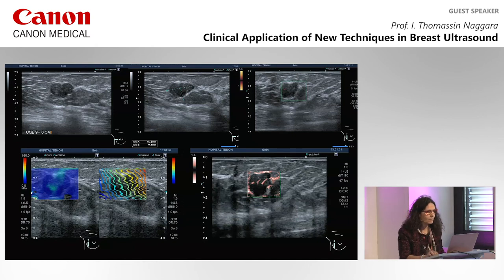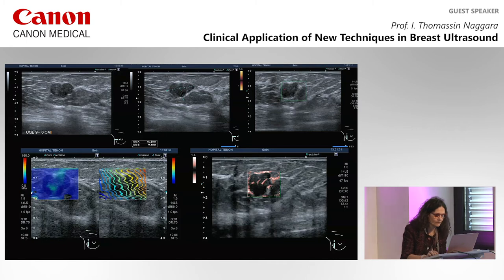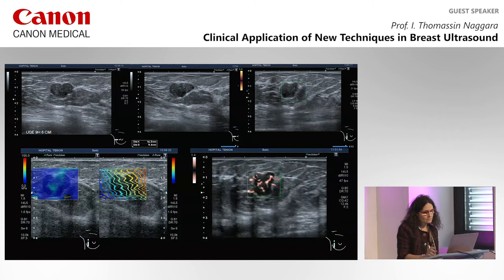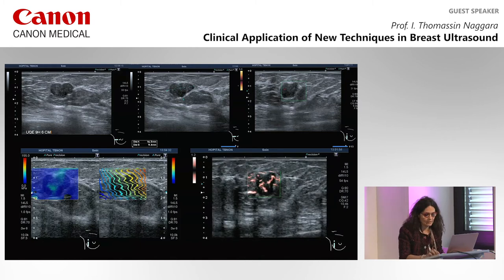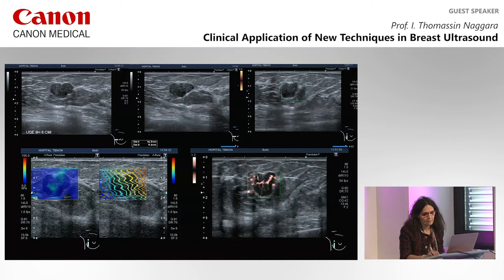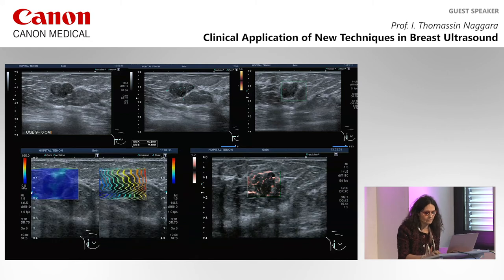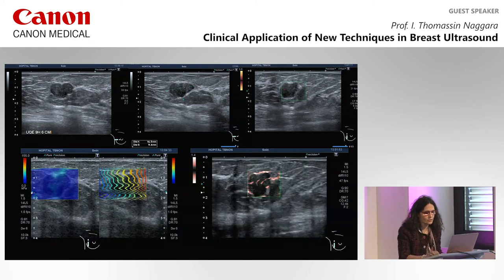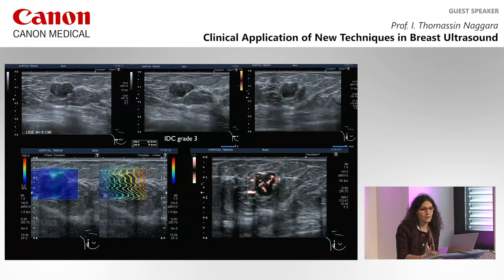Here is an example: a regular nodule that looks like a fibroadenoma. On elastography there is no significant deformability of the waves. When looking at SMI, you can see many microvessels everywhere with some branched microvessels. This lesion was not a fibroadenoma but was an IDC grade 3.